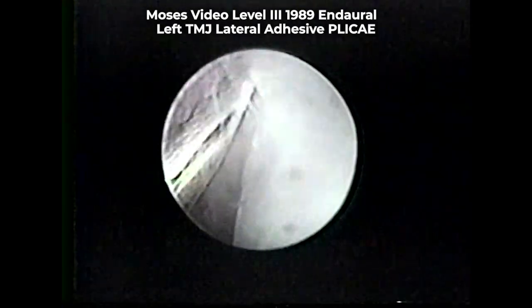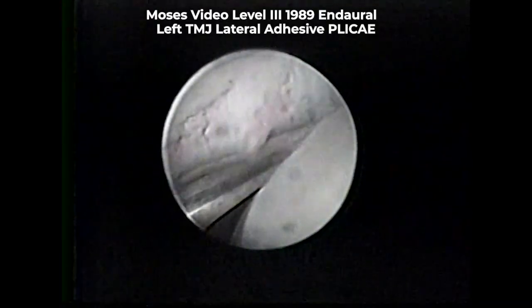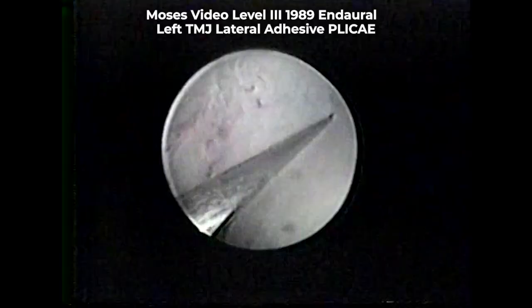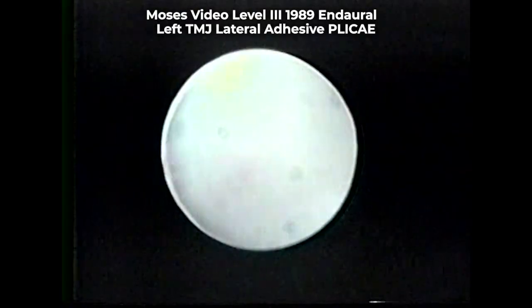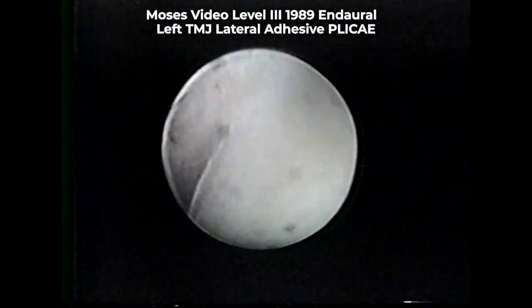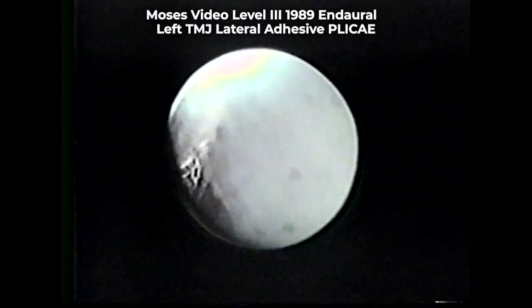An 18-gauge needle is used to dissect and free the adhesions from the articular disc as visualized in this videotape. Many times these are tenacious bands of adhesions. The proliferative synovitis can be readily visualized by the vascular markings and relative maturation of the adhesions.